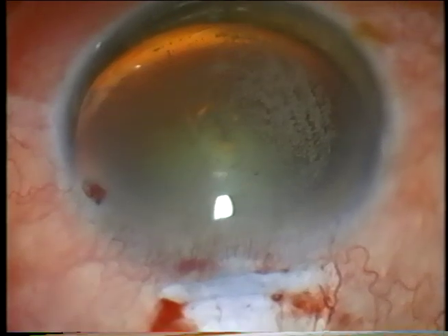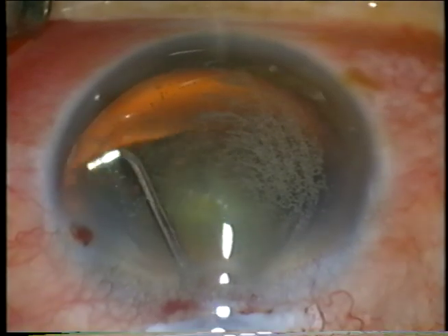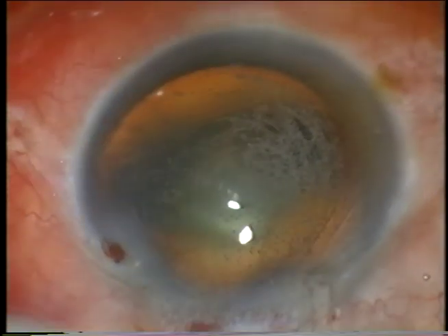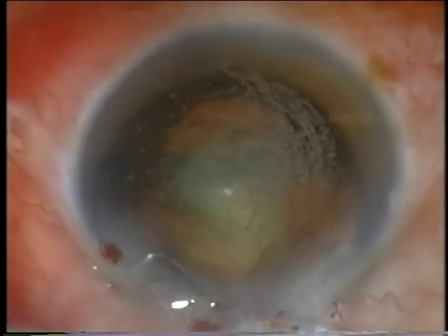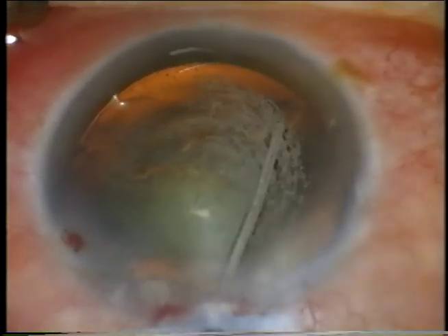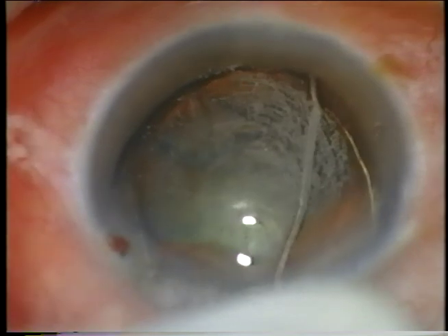Now we'll do hydrodissection. I use a bent 26 gauge needle, going to where I can see to get under it and hydro-free dissect until I'm sure I'm well under it, then little pulses of BSS until I get a fluid wave at least extending partway across the capsule posteriorly. Then I finish with a straight 26 gauge cannula for hydrodelineation and further hydrodissection.